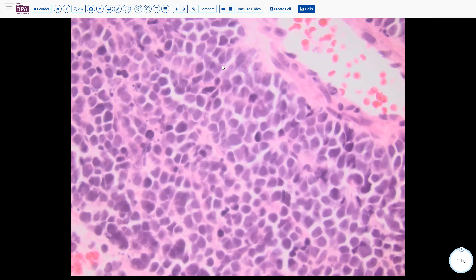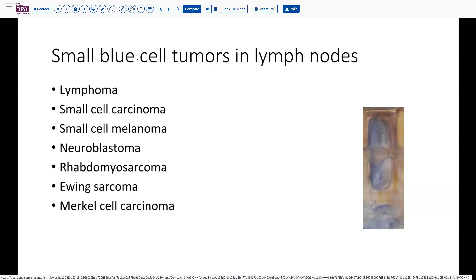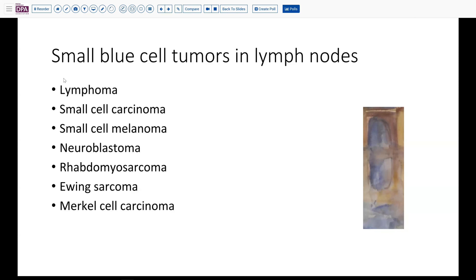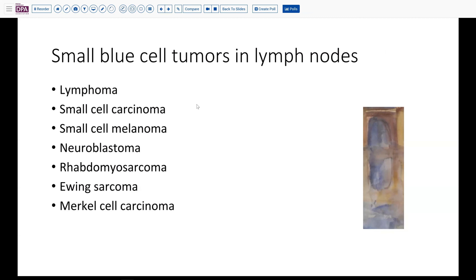Looking at the chromatin, you see a very diffuse pattern. So let's think for a second about what our differential ought to be in a situation like this in an adult, older adult. Lymphoma is certainly in the differential, although these nuclei do not look terribly like the nuclei of lymphoma.